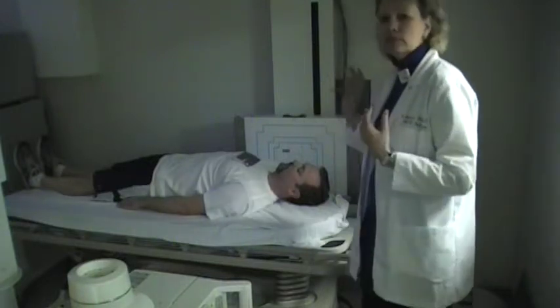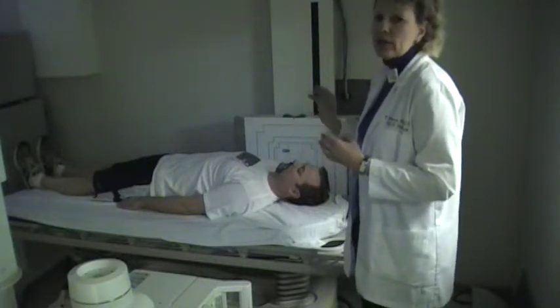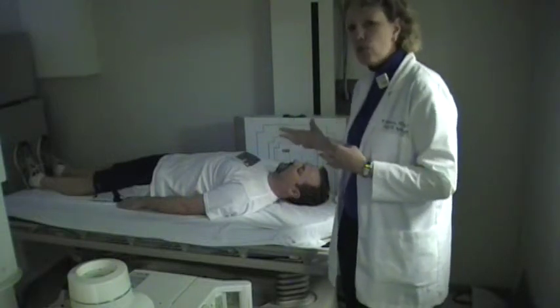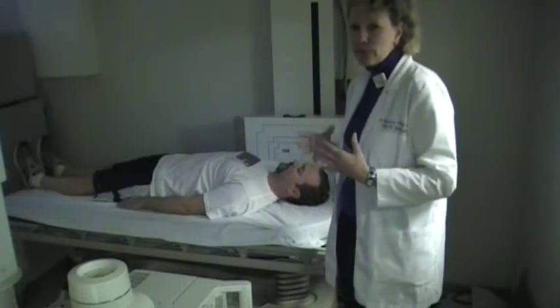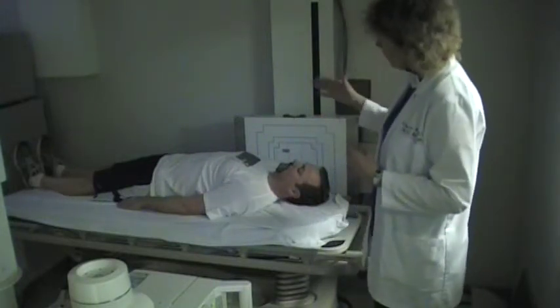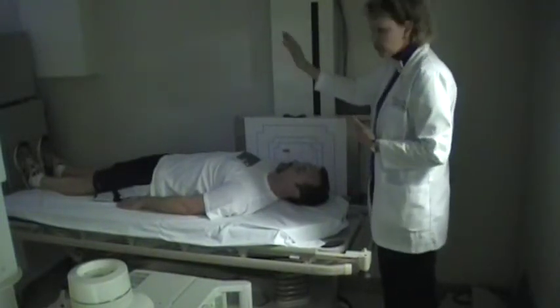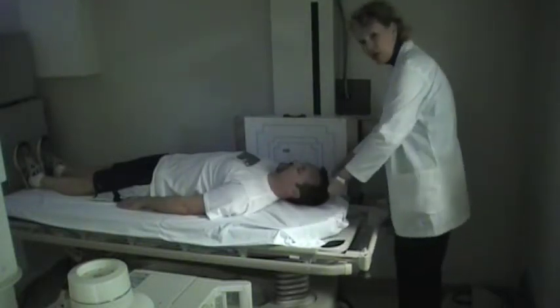When your patient comes over, sometimes they may have already been changed into a patient gown in the ER, or they're still fully dressed. Try to get whatever metal you can out of the way — jewelry or earrings — without moving the patient. That can oftentimes be very difficult, but just try to get as much as you can out of the way. Your patient is on a spine board; you and another technologist will lift the board and scoop the patient closer to the image receptor.